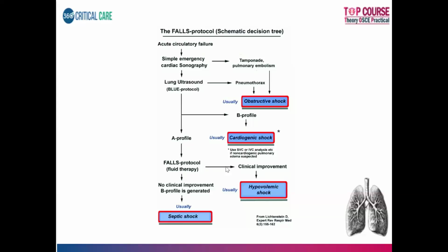So this is about the cardiac origin issues, or the cardiopulmonary problem. If you're thinking of pulmonary embolism, the tricuspid regurgitation would probably be higher. At that point in time, your TAPSE also would be changed. If it is going below normal, then it is an indication of RV strain. All of that can also be seen, but you will not have much time. Therein, you have to rule out these two pathologies, tamponade and pulmonary embolism.